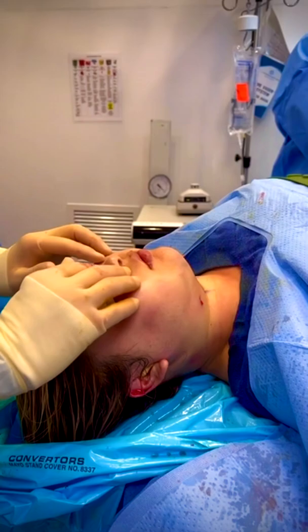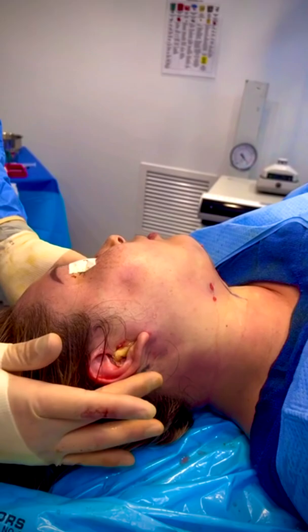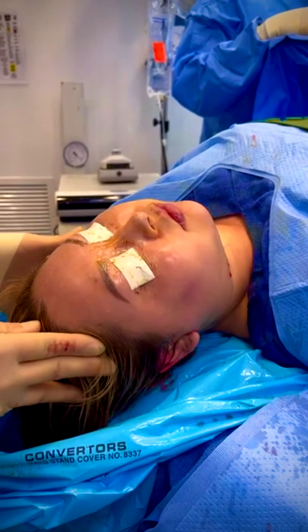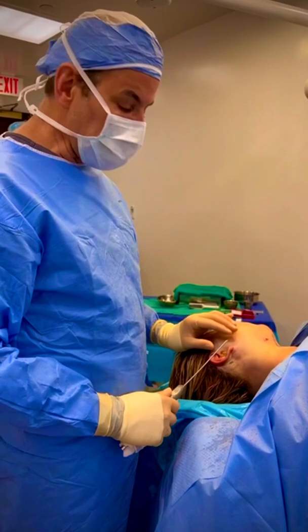So we just finished tumescent and you can see Sharon's got fullness in her cheeks as well as the neck area. We put in 604 cc. We injected behind the ears because we lift that skin up there — that's where we anchor MyElevate. And over here, we injected the cheek area because we're going to treat her with the Precision TX of her lower face and cheek area, as well as the right and left neck. We treat all the way to the base of the neck with the laser because we want to really rejuvenate her skin from all the way at the base of the neck to the area just below her cheekbones.